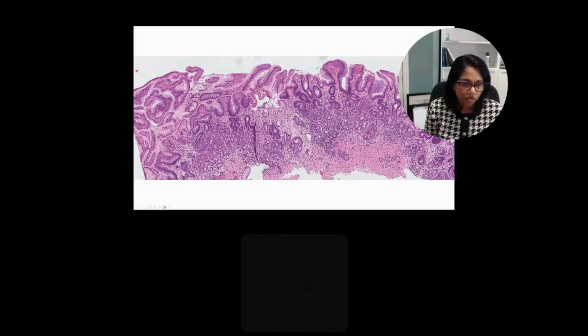You have little bundles or bouquets of this pancreatic heterotopia, and you get pseudopyloric metaplasia. Now, when encountered, how do you report these biopsies, or how do you formulate a report in general? Prior to this, as a general rule of thumb, it might be good to do a gastrin stain, because gastrin will obviously be negative in the body. If this is antralization of the gastric body, it would be nice to do a gastrin stain to prove that this is in fact body that has been replaced with metaplastic epithelium and is atrophic.